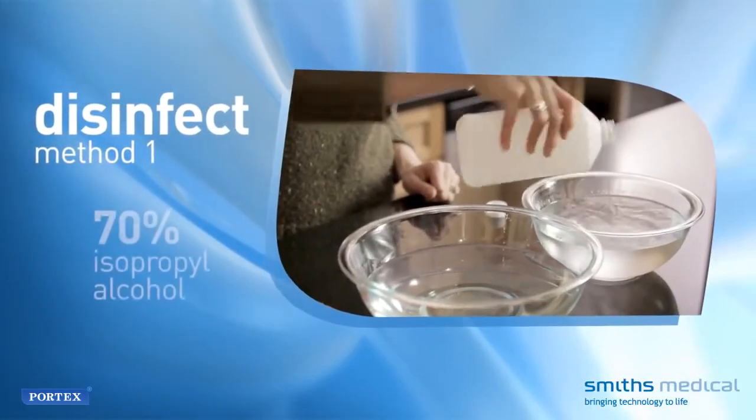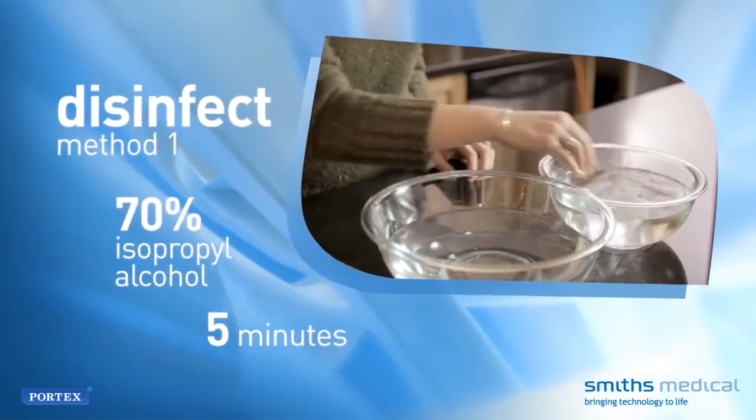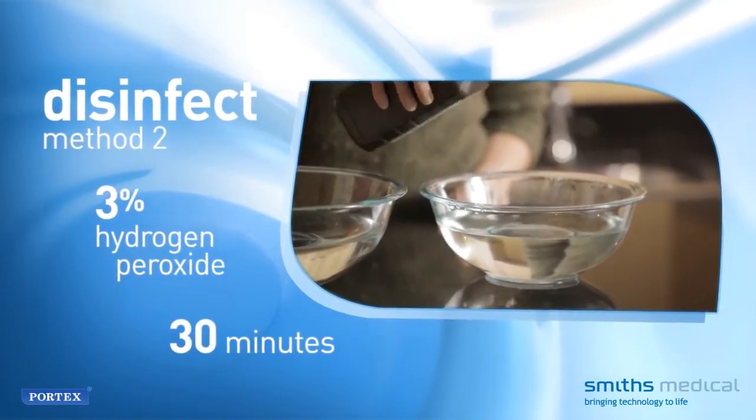Method 1: Place the parts of the device in a fresh solution of 70% isopropyl alcohol for 5 minutes. Method 2: Place the parts in a fresh solution of 3% hydrogen peroxide for 30 minutes.